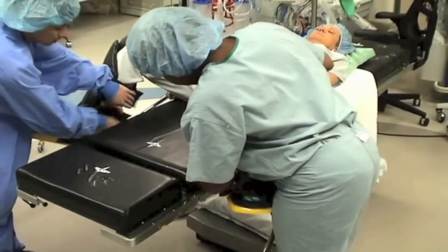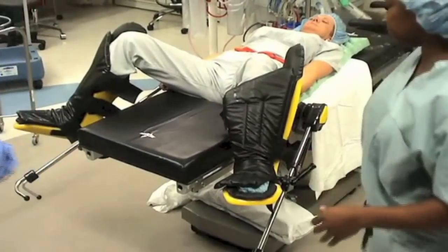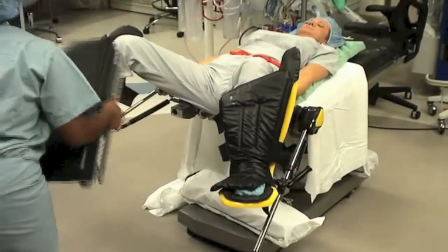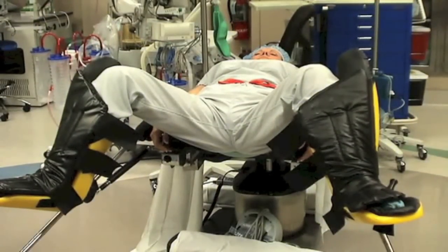The straps of the boot are tightly secured bilaterally, and the foot of the bed is removed to allow for access to the vagina. The legs are positioned appropriately when the legs are symmetric, with the knee and the foot aligned with the contralateral shoulder, and the buttocks located at the edge of the bed to allow for manipulation of instruments within the vagina.